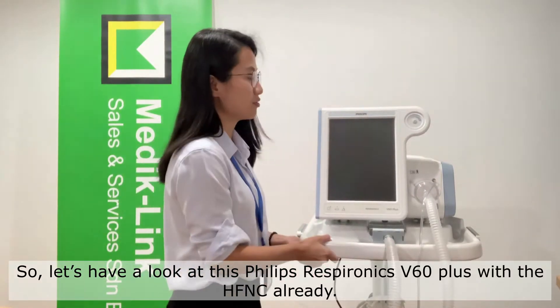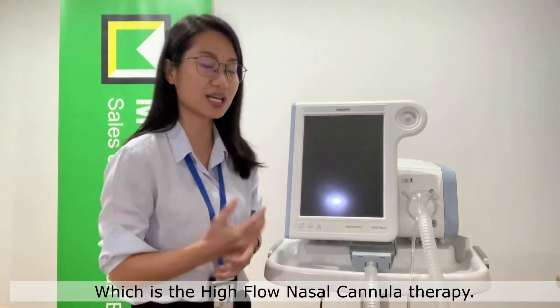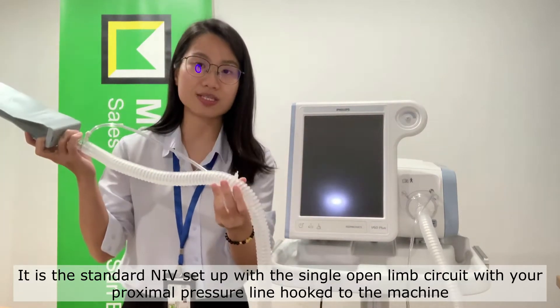Let's have a look at this Philips Respironics V60 Plus with the high flow nasal cannula therapy already installed. This setup you might be familiar with — it is your standard NIV setup.